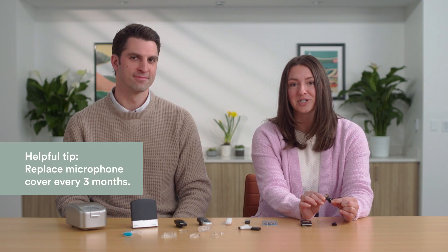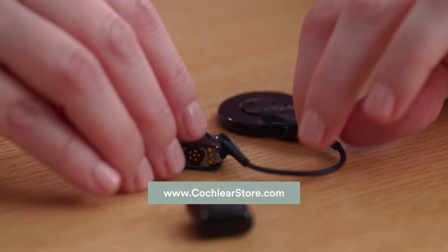This is the microphone protector. It needs to be replaced every three months in order to optimize sound quality. You'll have extra microphone protectors in your kit and can order more from the online Cochlear store.